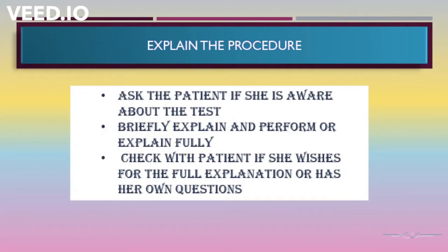Go on to explain the procedure to the patient. Ask the patient if she is aware of the test. Briefly explain and perform, or fully explain the procedure accordingly. Check with the patient if she wishes for the full explanation or has her own questions at the beginning and at the end of the procedure.